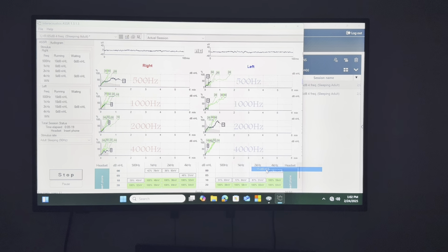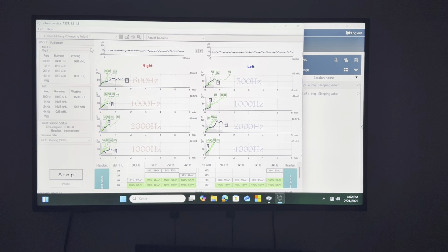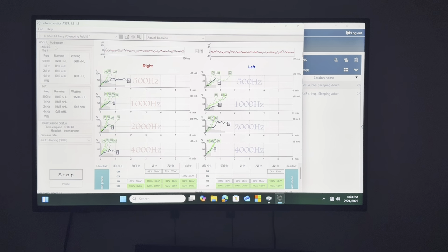So it's only 5 minutes. Right side, you already know that it's normal hearing. I think applying the correction factor, we already know it's normal hearing. If you can click on that audiogram tab on the left. See, it's applying the correction factor, it's all normal hearing. So 5 minutes I have done a noise notch. Still normal.